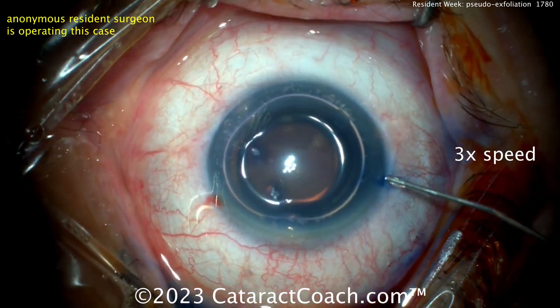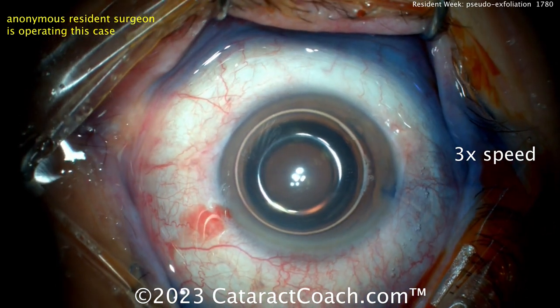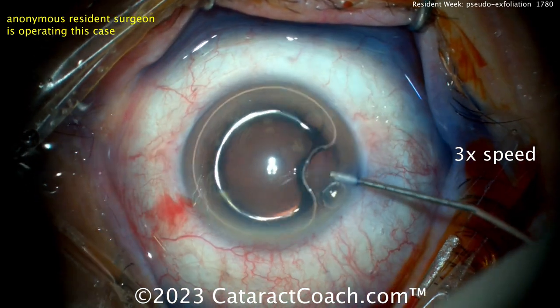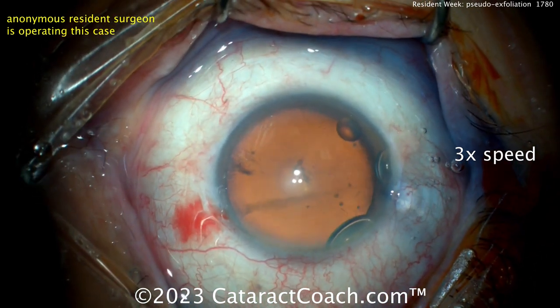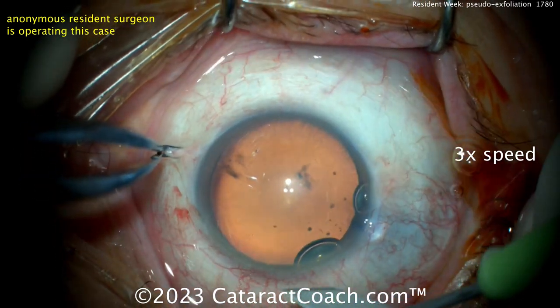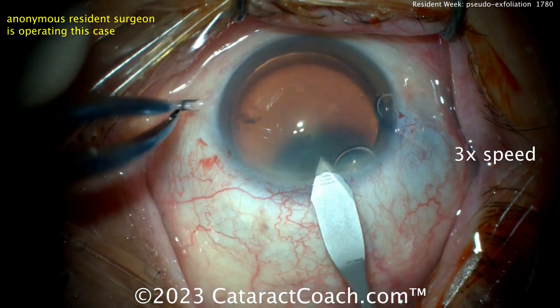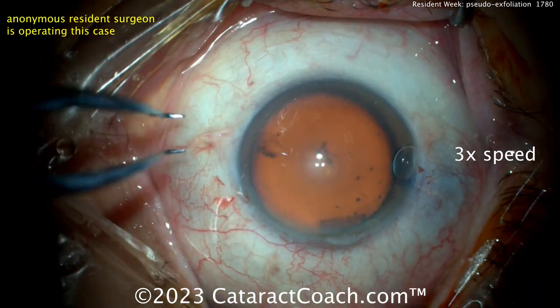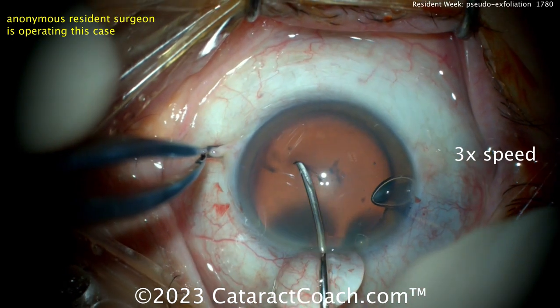Trypan blue dye. We don't typically stain a lens like this — I know residents like to. The trypan blue dye is really not needed if you have a good view anyway; there's a beautiful red reflex. It does help to stiffen the lens capsule, making it a little less elastic, so I get why people like it. But it does incur a cost — here in the USA you're looking at about $60 per vial of trypan.